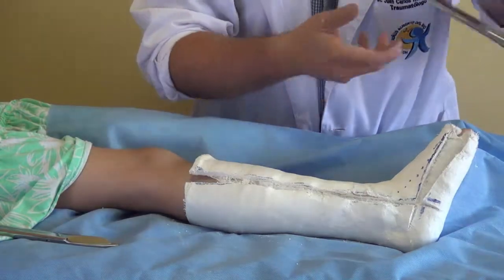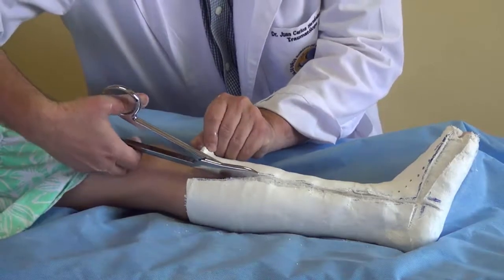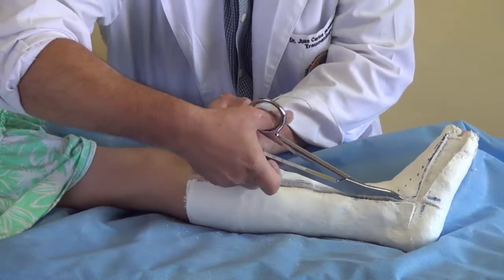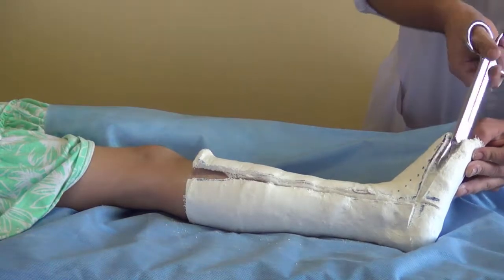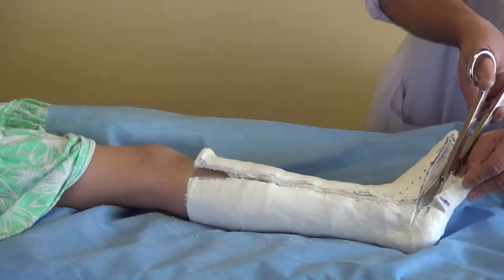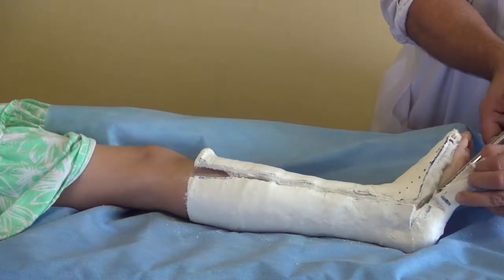At the end, we use the scissors to cut the padding and the cotton. Then we take off the whole cast.